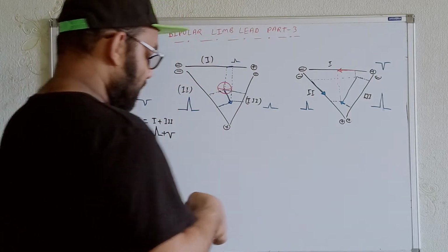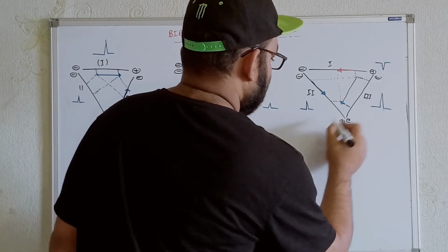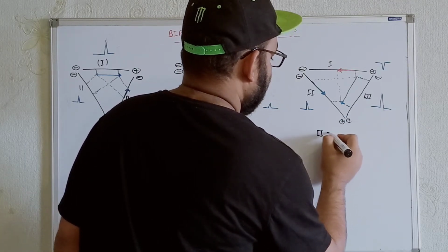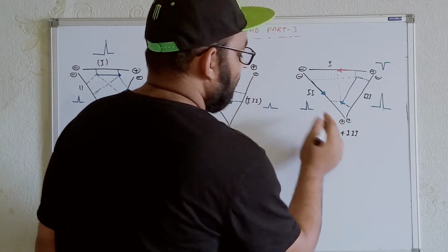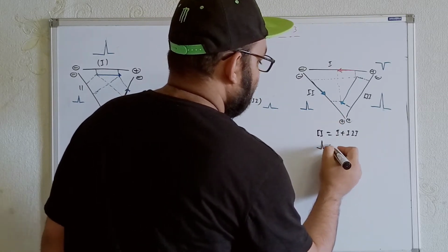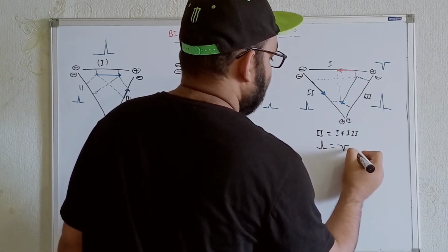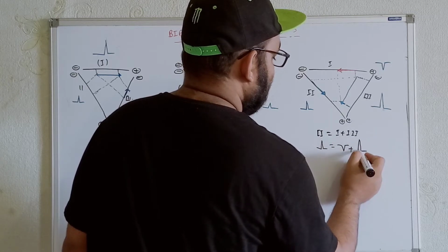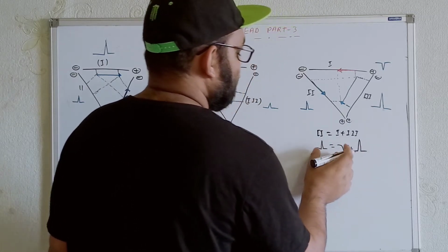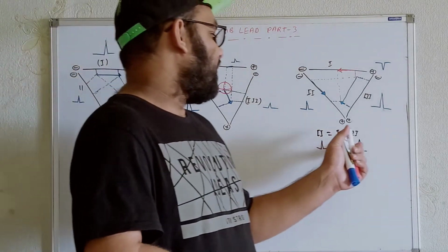Now if you do the addition over here, try to understand. Lead number 2 is just lead number 1 plus lead number 3. So for lead number 2, we got only a small deflection over here. For lead number 1, we got the negative deflection, and for lead number 3, we got a stronger deflection. If we subtract, then definitely we are supposed to get lead number 2. So still, we see the Einthoven's triangle holds over here.